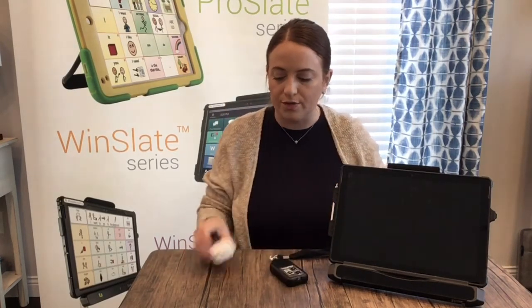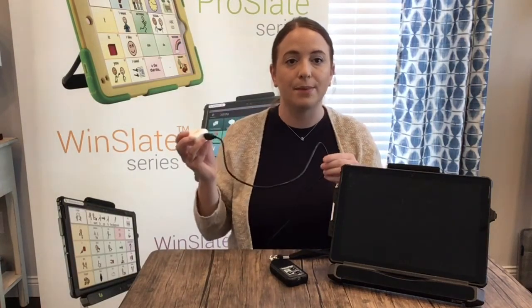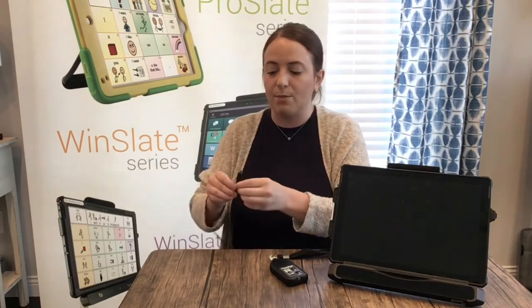To charge it, you want to find the white brick that says sound pod charger and the black cord that's labeled sound pod charger as well. Plug those in together. Take the brick — you can put this into the wall, or like what I'm going to do, plug it right into the power cord.